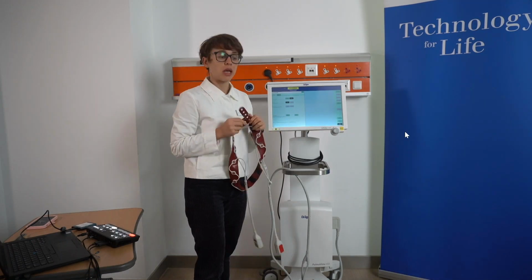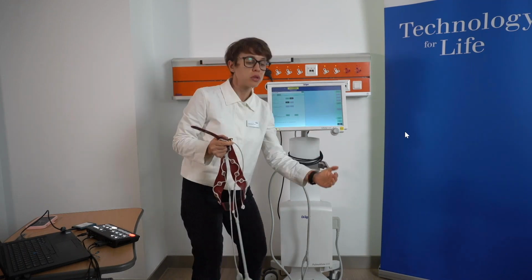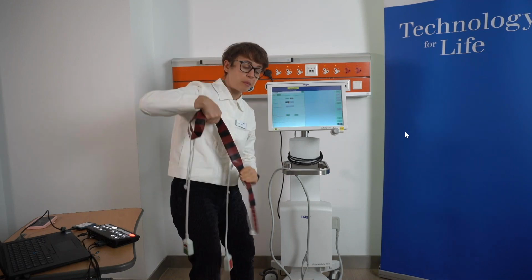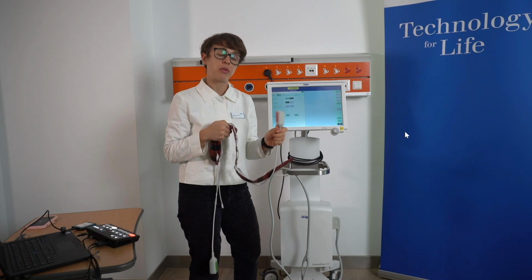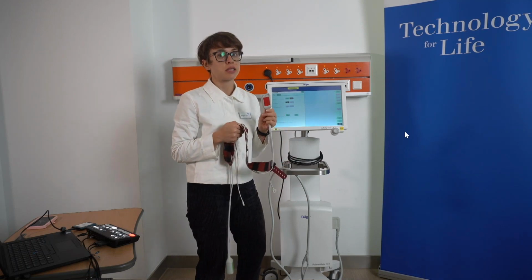The other way is when you have a patient, you can rotate the patient on one side and slide the belt in under the patient, but the challenge is this cable extension. Usually this cable extension gets stuck somewhere under the patient.